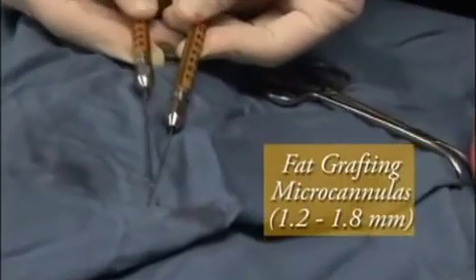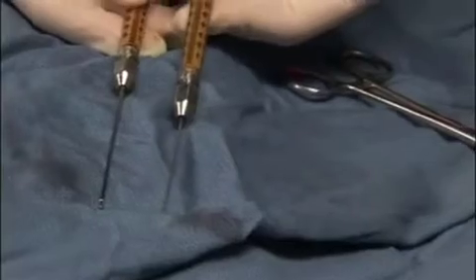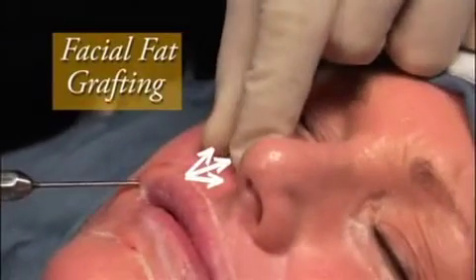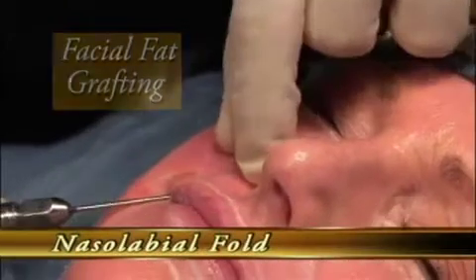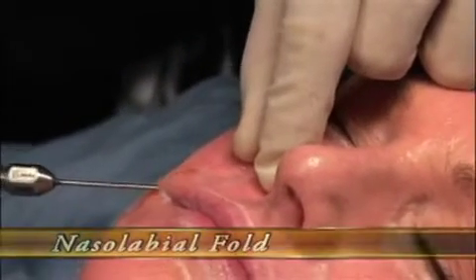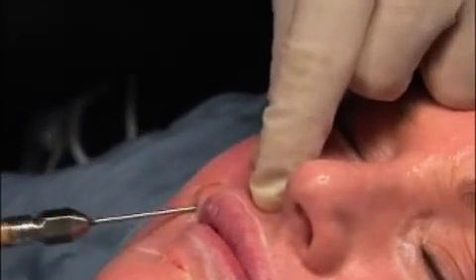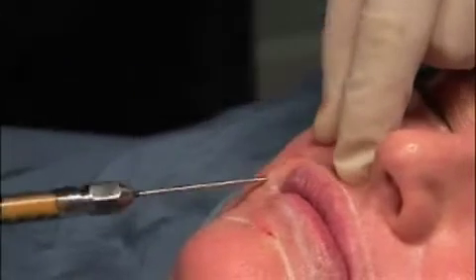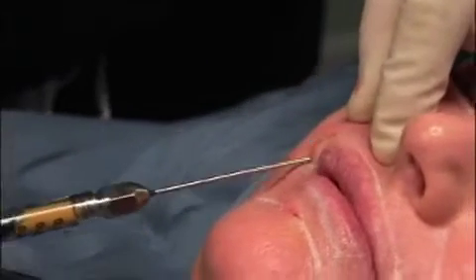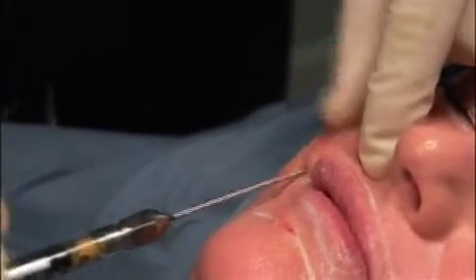Fat grafting microcannulas 1.2 to 1.8 millimeters in size are used for grafting to the face. Micro droplets of fat are distributed along the areas of volume deficiency. Here, at the nasolabial fold, besides micro droplets in a linear fashion, a fanning technique is used to deposit the fat both inferior along the nasolabial fold and superior to the nasolabial fold.